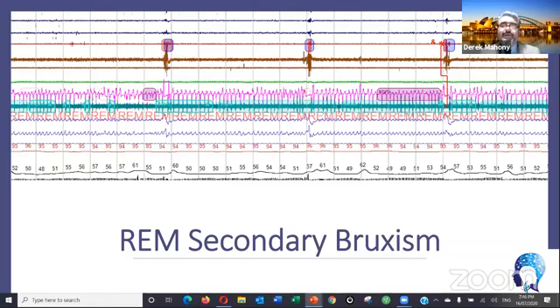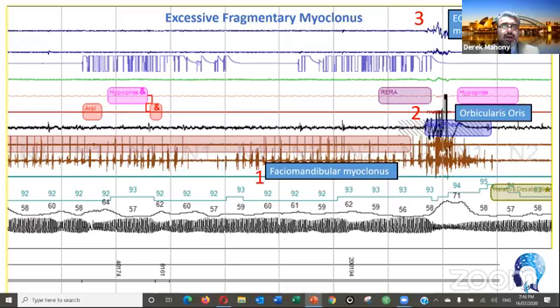Do you want me to just go forward now and you can continue? This little slide here, I like it because it explains the without tooth contact part. This is a particular patient who was sent because they have temporomandibular disorder, and they've got tooth grinding or gnashing that's absent throughout the night.